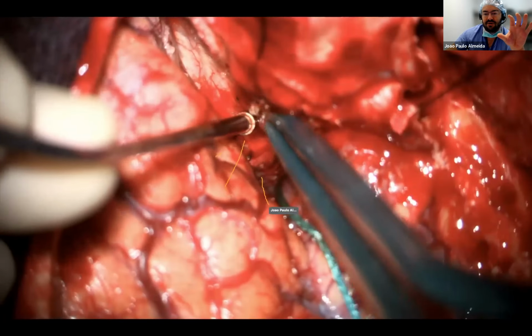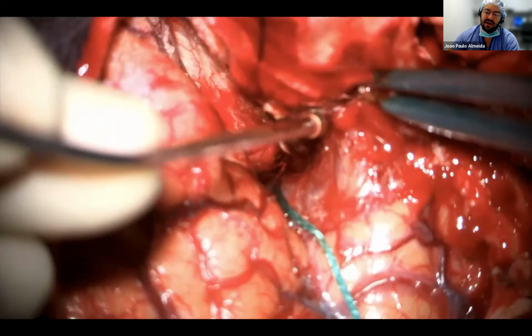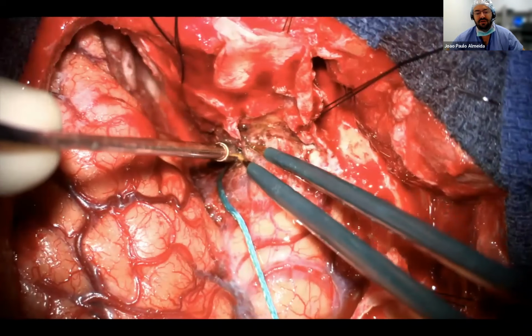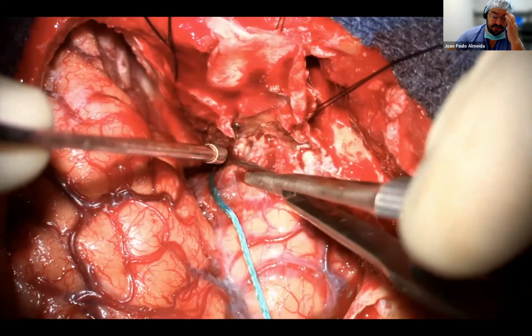Once we get that proximal control and relaxation of the brain, then go back ahead here to the dura and then just separate that dura a bit. And then we're not going to touch anywhere close to the fissure as a first step.